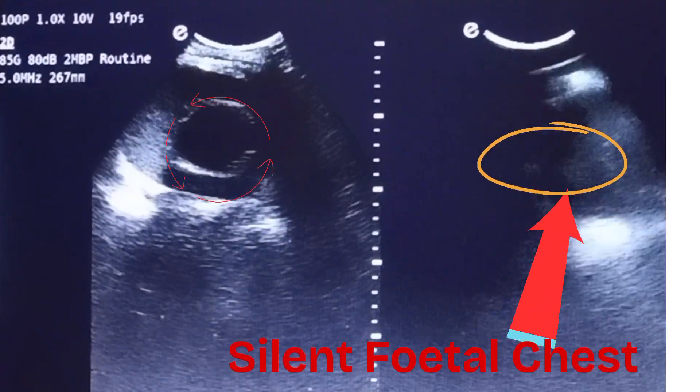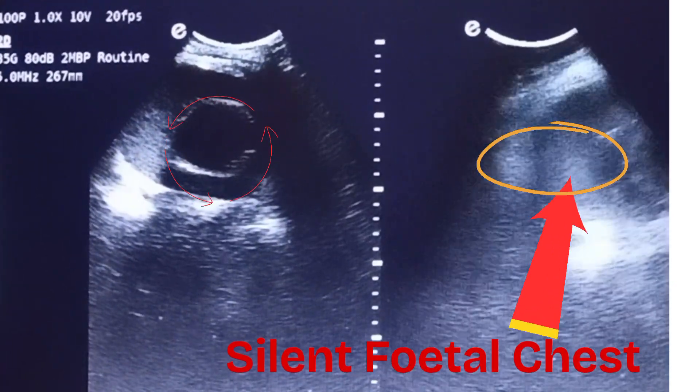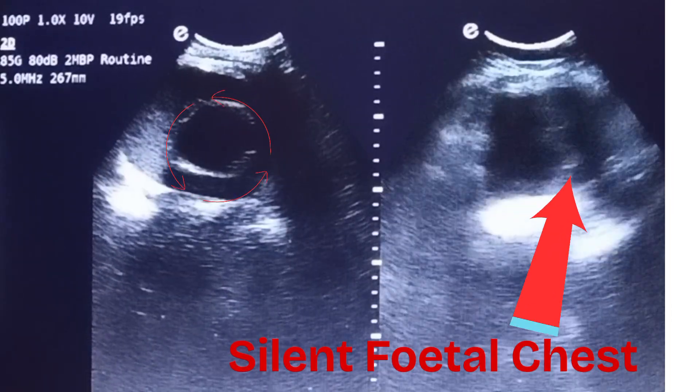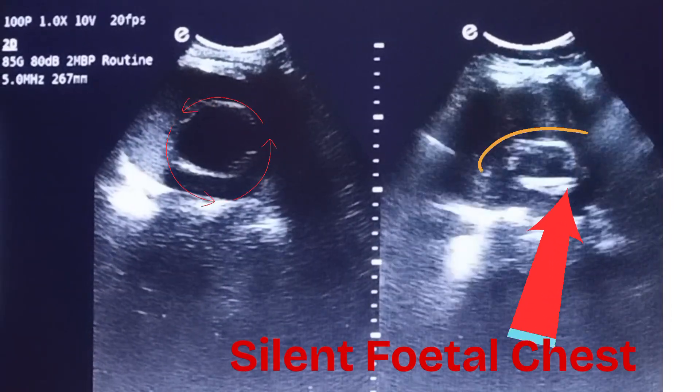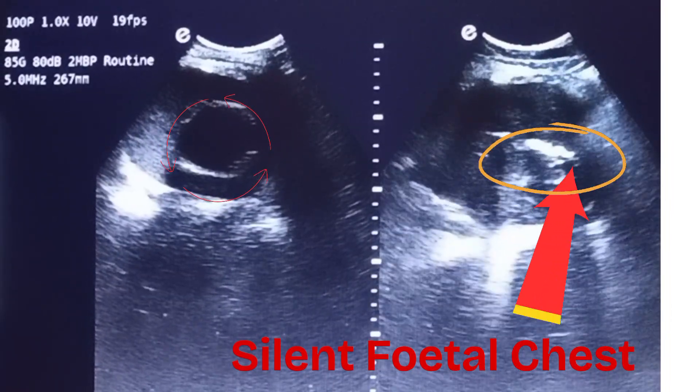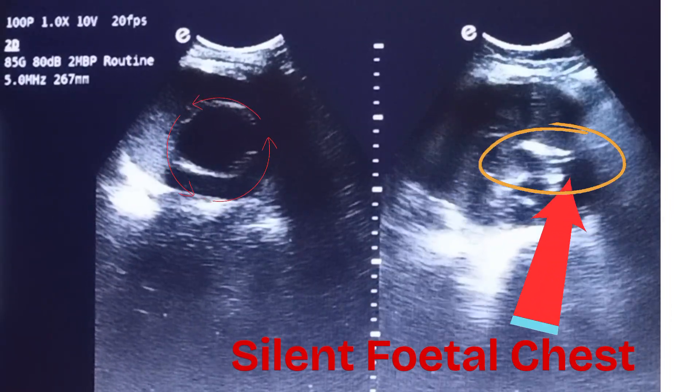During a normal alive fetus, movements of the ribs can be seen during breathing. But here the fetus is not alive, so we find a silent chest without any chest movements.